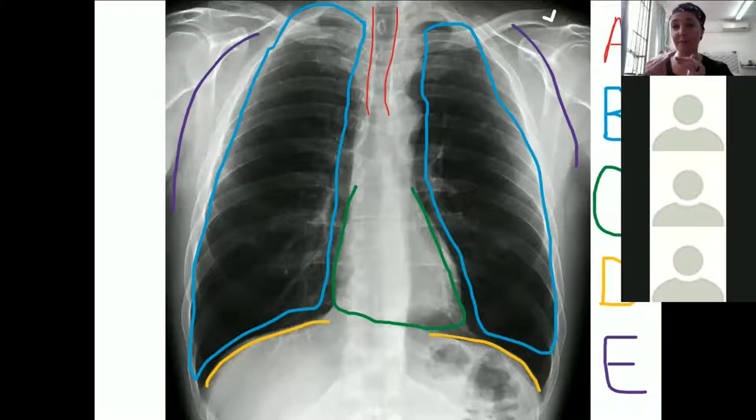Is maybe the diaphragmatic, is your diaphragm obscured by something in the way, potentially some fluid or potentially underlying lower respiratory tract infection? And then E for anything extra. Anything else you want to be having a look at that you want to be aware of on this x-ray.